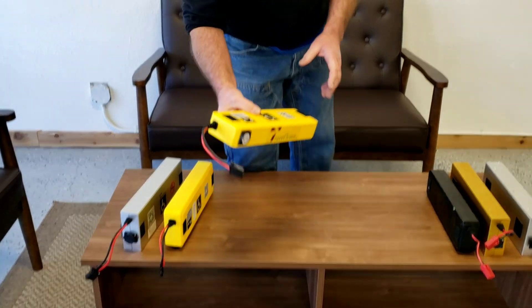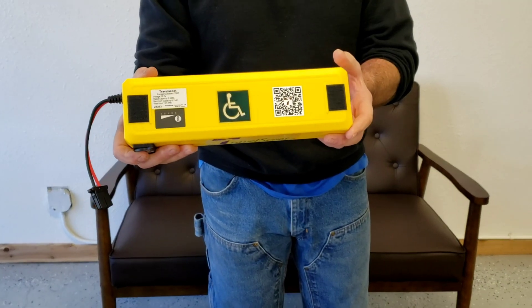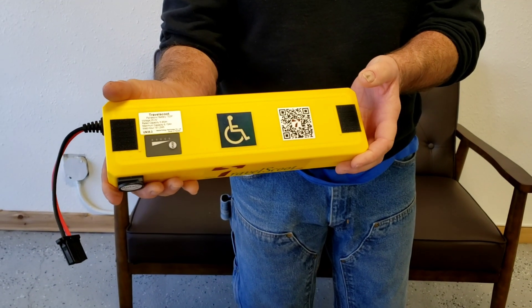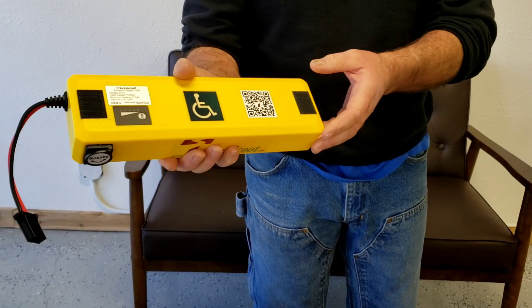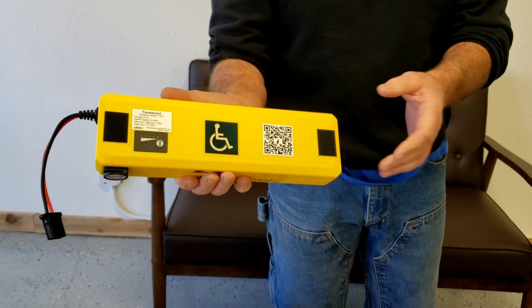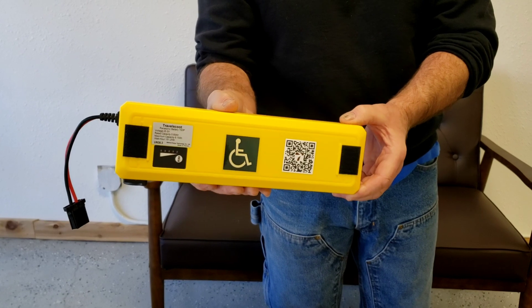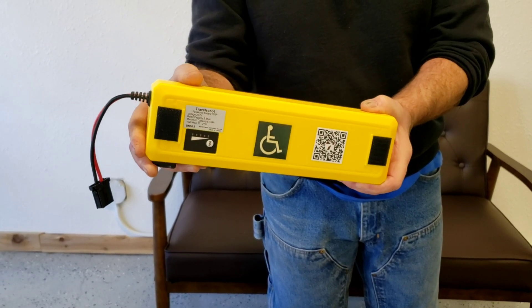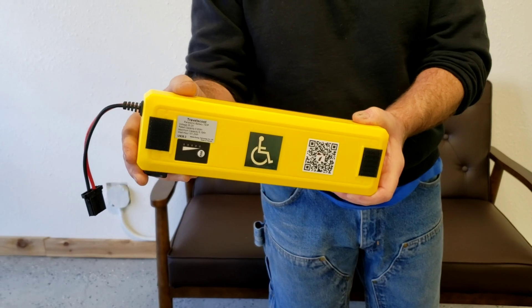We're going to start with our smallest 151 watt-hour, air-travel-approved lithium-ion battery. This is a three-pound battery that will provide a range of anywhere between six to nine miles per charge for a rider weighing between 200 and 220 pounds on level pavement.